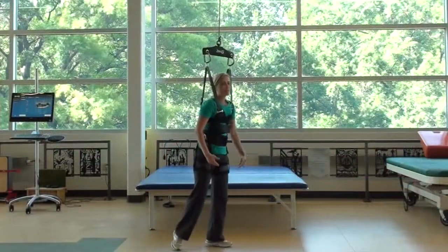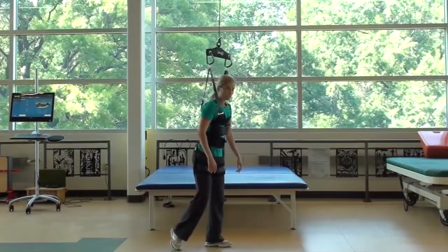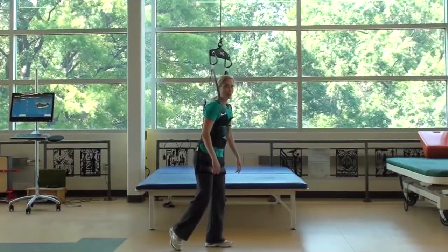Now I'm on 50 pounds of unloading, so it's going to make these one-leg lunges a lot easier.